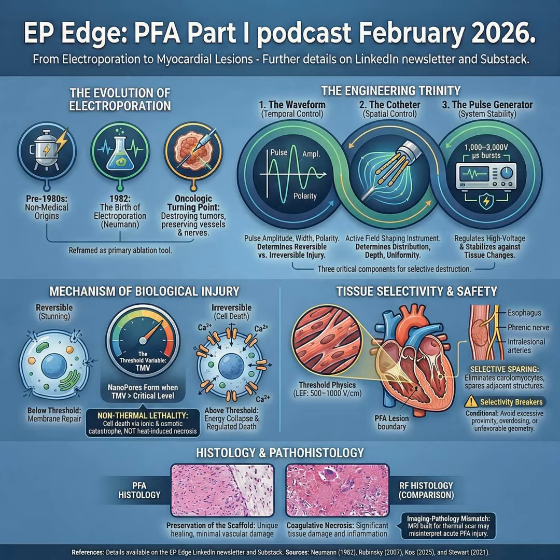The translational turning point came next, in oncology. Oncology is where electroporation became an ablation strategy. First, there was electrochemotherapy, using pulses to enhance uptake of chemotherapeutic drugs into tumor cells. But then investigators pushed beyond the reversible range. They realized that if you intentionally exceed the threshold, you can ablate tissue through irreversible membrane failure without relying on thermal injury. Irreversible electroporation, IRE, showed that you could kill cells while relatively preserving extracellular matrix architecture.